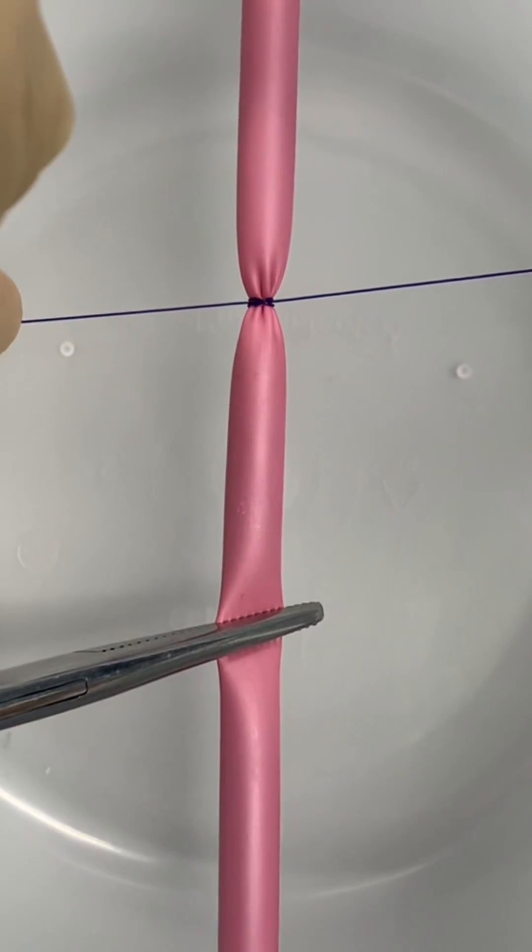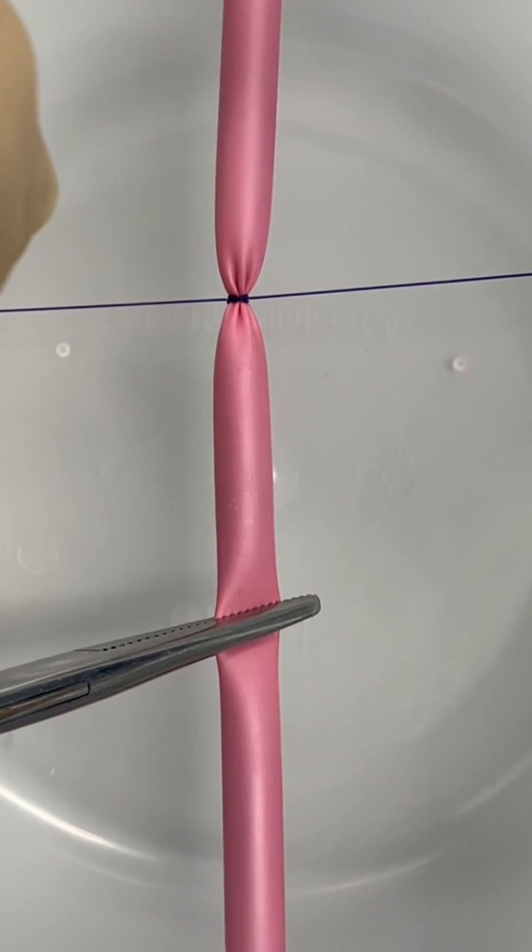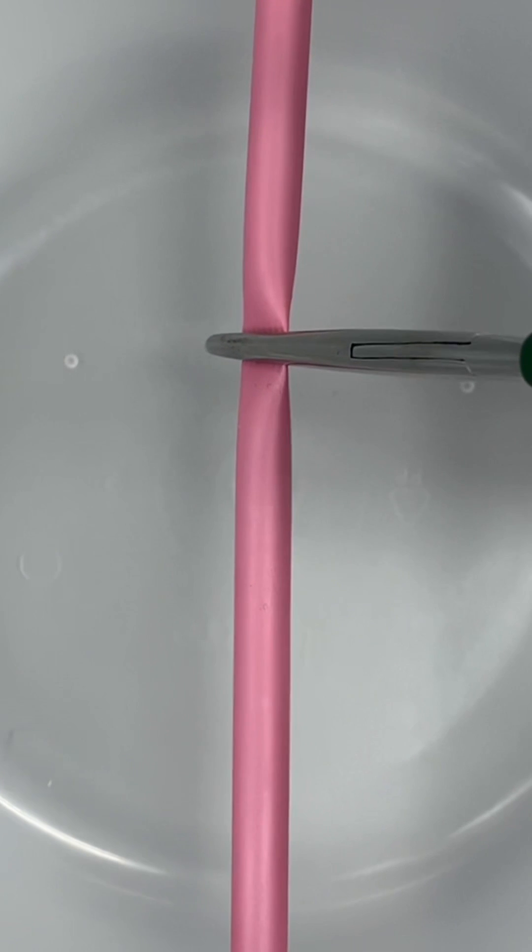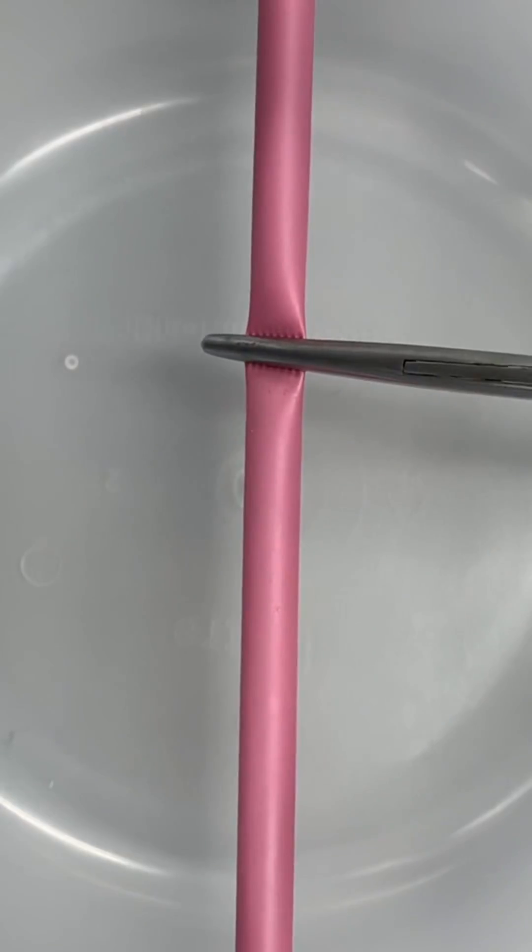The constrictor knot is one of the best ligatures to tie off blood vessels during surgery. If you encounter a very large vessel that needs to be cut, this is what you can do.